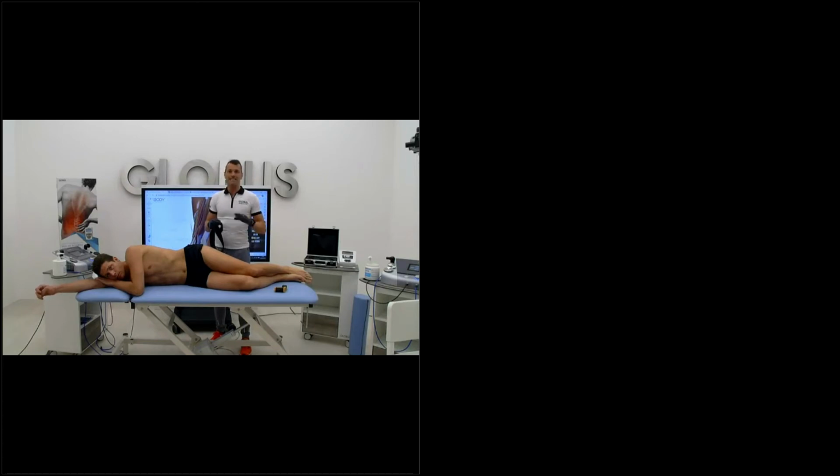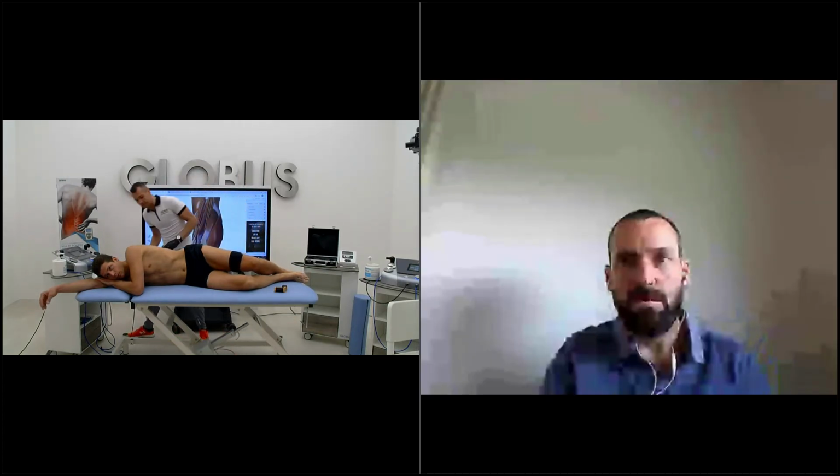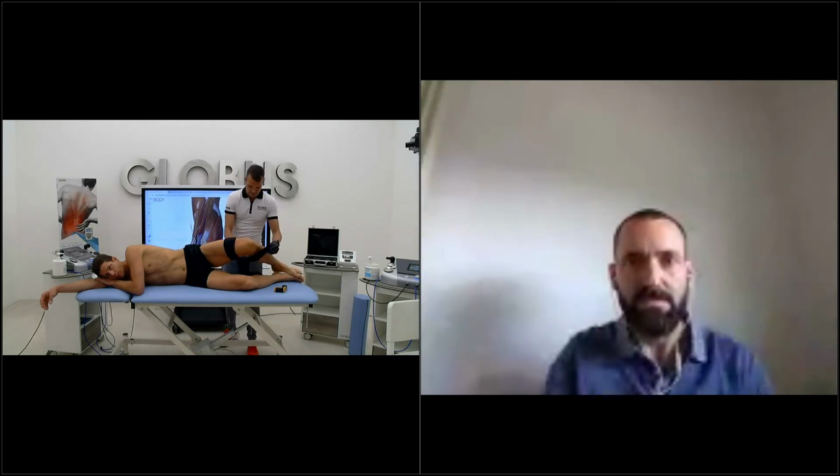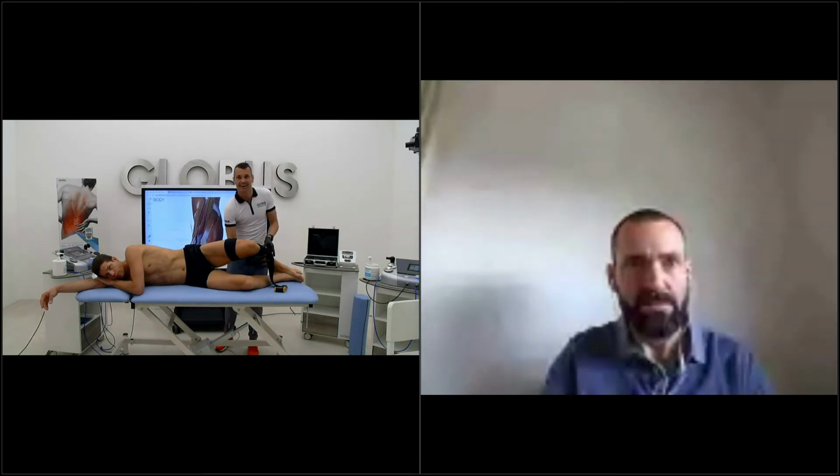So let's do this. I do the first example, in the case of the fascia lata treatment, and maybe later you can suggest other different options. I suggest one, just to put one band here, and the other one over here. I use the DIA trigger, but it's similar.